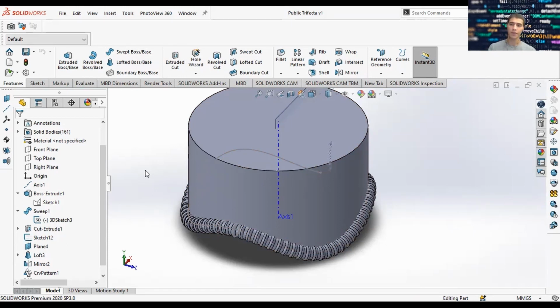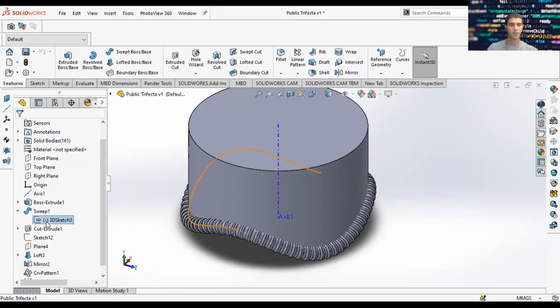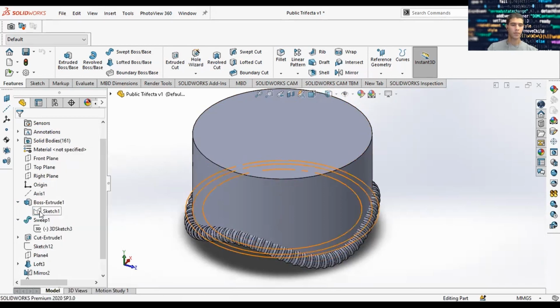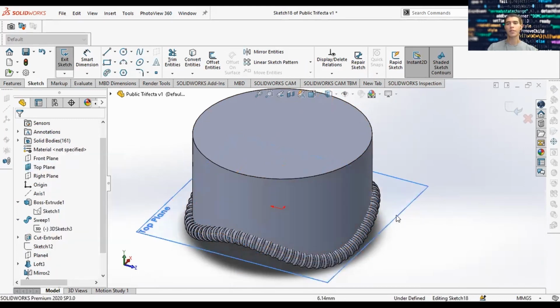So now what we're going to focus on is creating the valves. And to do that, allow me to introduce you to something called a spline. But first, let's clean up this space that we have here. Let's hide the sketch. Let's hide this plane. And we'll hide this sketch. And bring back our top plane. Now we'll sketch on our top plane.